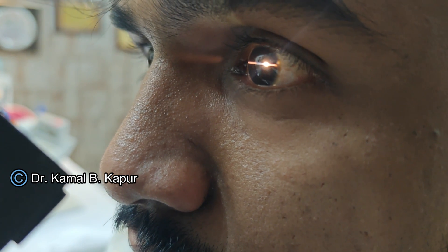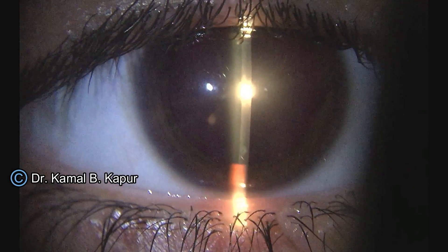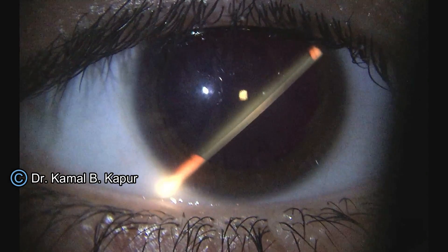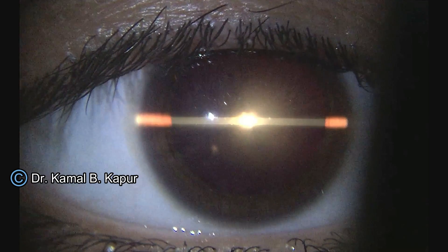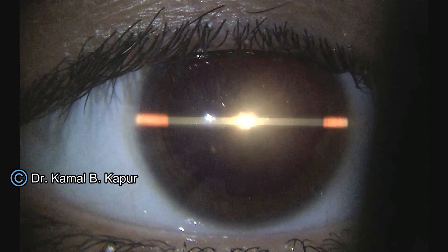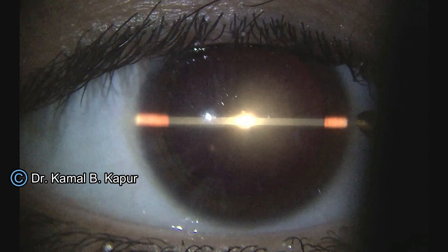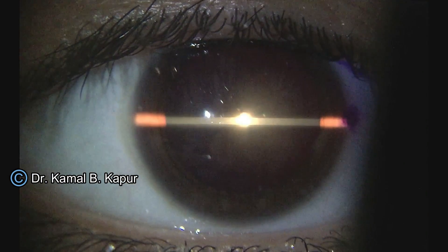Ask the patient to put their forehead into the slit lamp and look straight into the light. You will have a horizontal slit beam going across the cornea. Make the beam 0-180 degrees and ask the patient to look into the light. Bring the slit beam to a level where the central corneal reflex is in the center of the slit and the two edges are on the limbus. Then mark the limbal edge, always ensuring that the central corneal reflex is in the center of this straight line.